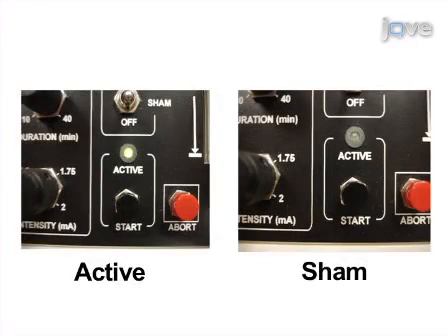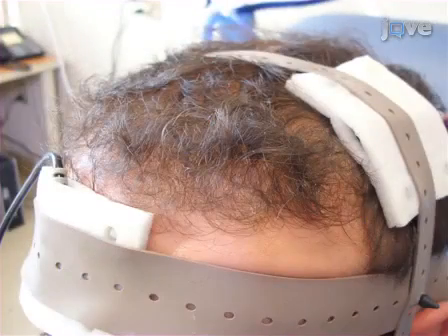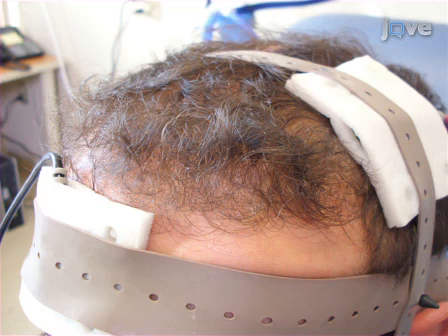With proper setup, the TDCS device should indicate that current is flowing during active TDCS stimulation, or the device should display sham mode when running a sham stimulation procedure. Of note, even with the device indicating that current is flowing through the system, current might be shunted through the skin. In order to avoid this, it is recommended to have sufficient distance between the electrodes. According to modeling studies, we recommend this be at least 8 cm when using 5 by 7 cm electrodes.